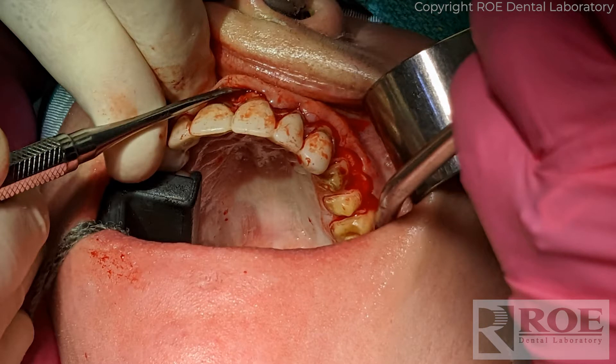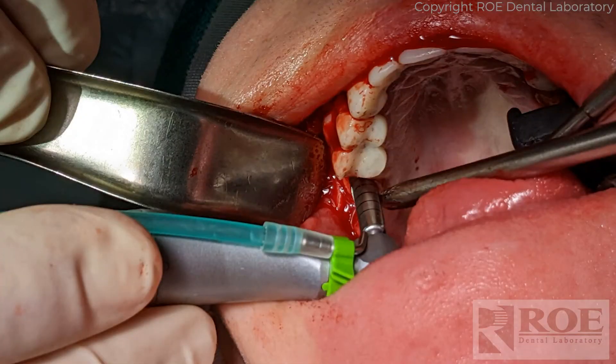In this case there was a little discrepancy on one tooth — not quite sure why — but we had to adjust the inside of the pin guide for the lingual of number 4 until the pin guide seated fully and confirmed. Then the tissue is flapped — labial flap at this point, minimal lingual, mostly labial, as typical.